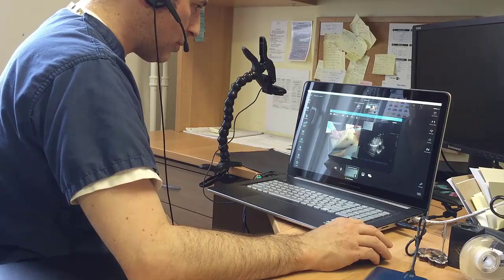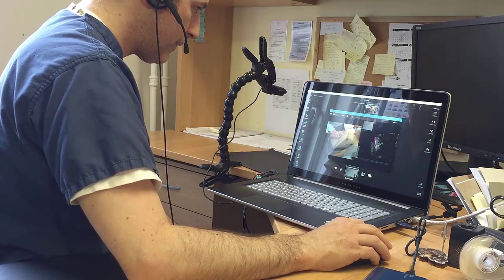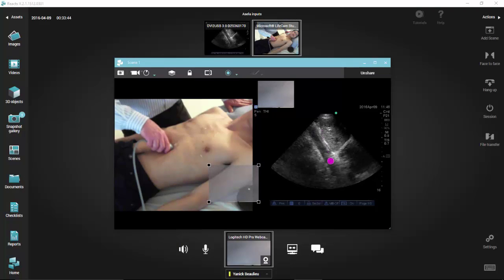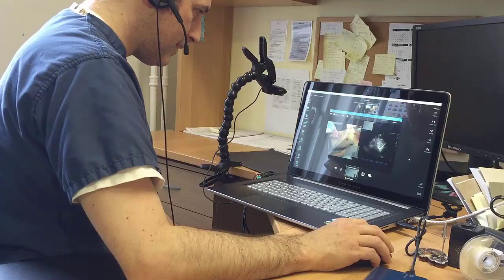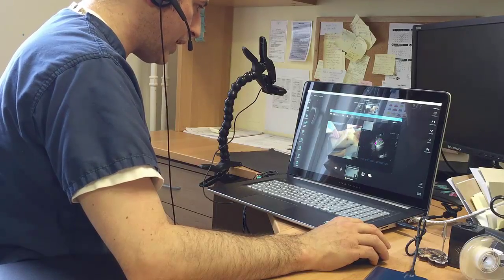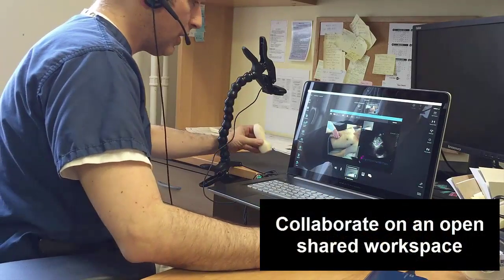So here, once in a while, we see a structure pass. What is this structure here? Because that looks like a nice vertical structure. It's a calcified wall. Is that the aorta? Yeah, it's the aorta, and it's behind the liver. So you're a bit too medial. You have to go more lateral.